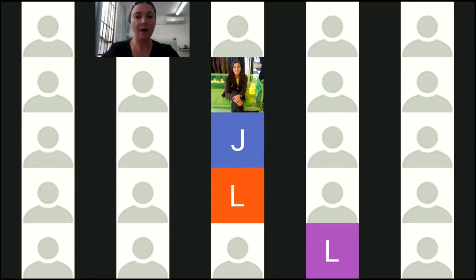Thank you. It's a really good question. So just to recap, the question was, would you put in a chest drain? And there's two questions. Would you put in a chest drain for every patient who's got TB and a pneumothorax? Or would you put in chest drains ever for a patient who's got TB and a pneumothorax? So would you put in a chest drain ever? Yes. If you've got a big pneumothorax, you tend to find that that lung's not going to re-expand by itself. So a big, massive pneumothorax, even though the underlying cause is TB, yes, I would put in a chest drain.